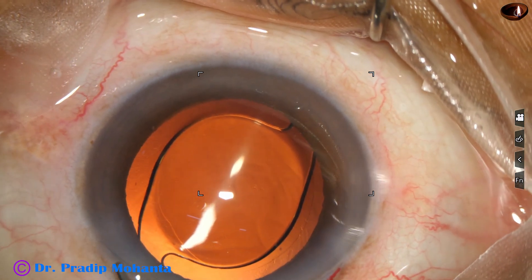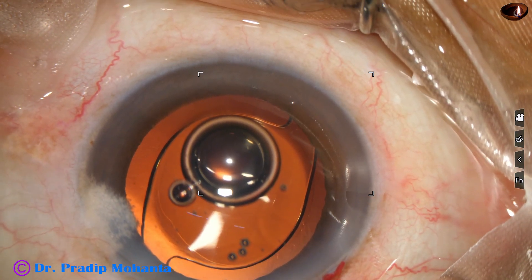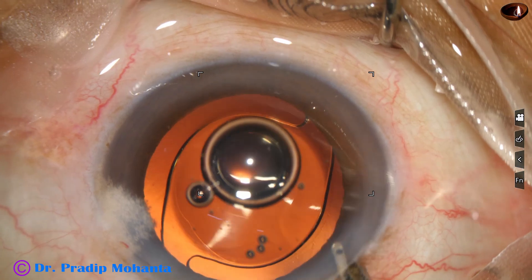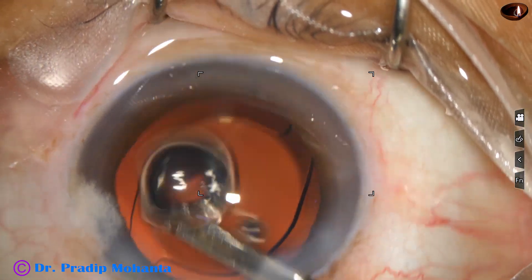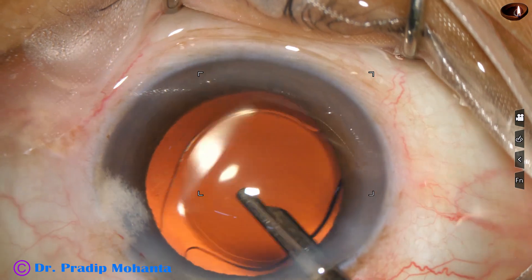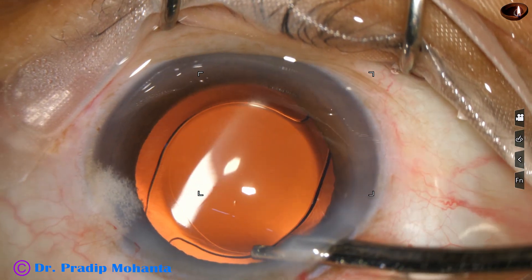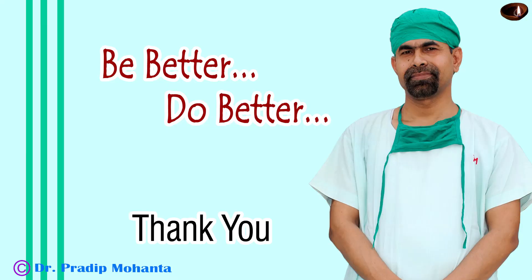Moxifloxacin is injected into the anterior chamber. The side port is closed by hydrating the corneal stroma. A final lavage of the anterior chamber is done — at this time, whatever viscoelastic sticks to the corneal endothelium is also removed. The anterior chamber is formed nicely, and the case is concluded. Thank you very much for your attention. Hope this video will help you in developing your surgical skills. Be a great surgeon and serve your patients with love, respect, empathy, and great surgical competence.